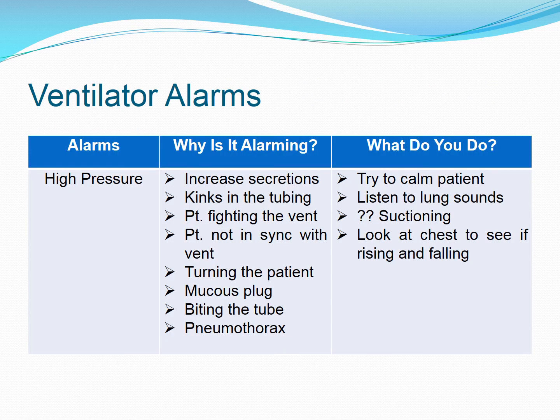Okay. All right, so ventilator alarms are something else that you do need to know about. The ventilator is always trying to push air in. That's the goal of the ventilator. So you need to assess and treat the high pressure alarm before you silence it. So you need to find out what's causing it first. The most common cause is secretions or a mucus plug.